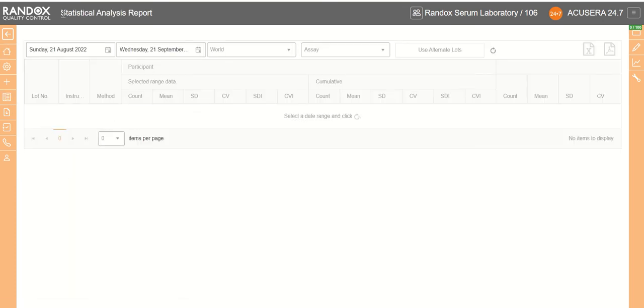When we click on this, our header changes to the statistical analysis report. We have our date ranges to look at. We have the choice of deciding if we want to look at the world peer group or if we want to look at a group that we're already part of, such as a lab group if you're an individual lab. Then we can look at it by assay, by just the instrument, or by method. We can also use alternative lots, and once the data has been generated, we can download this data in Excel or PDF format.